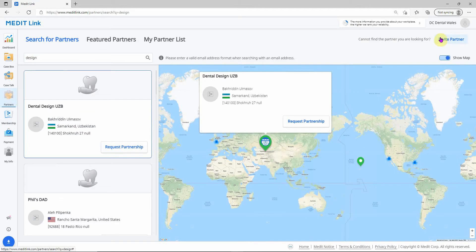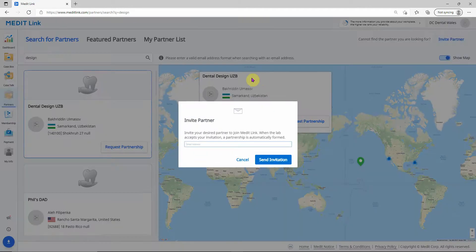If you can't find them on here, just click invite partner, type in their email address, and it will send them a link to download the software and partner with you at the same time.